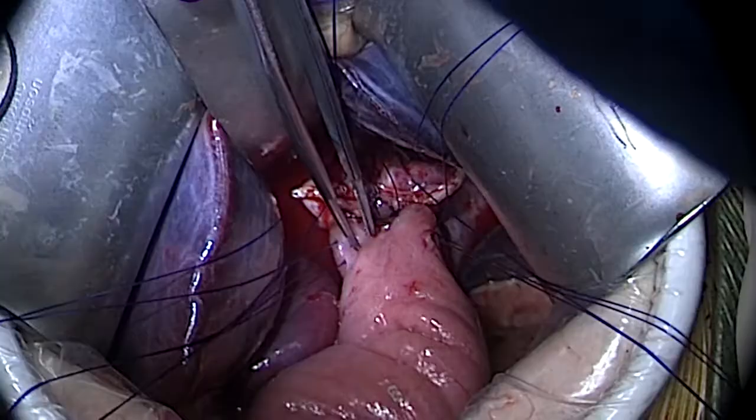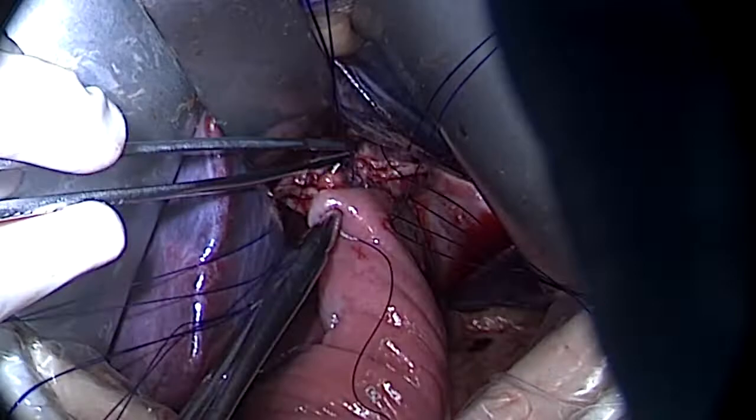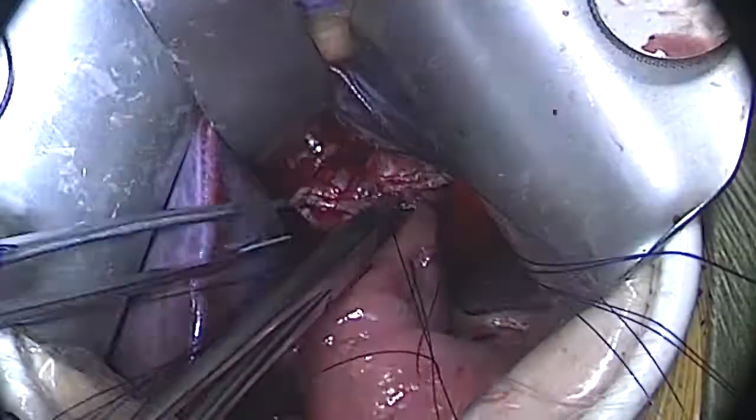The common channel is then closed with interrupted 3-0 PDS sutures that are tagged and then tied down in a sequential fashion.